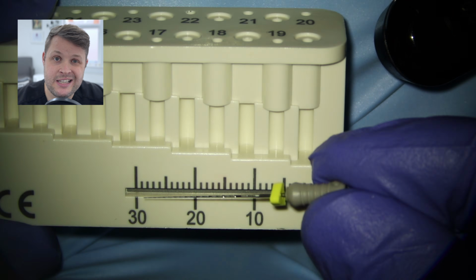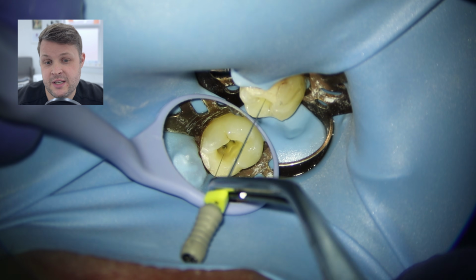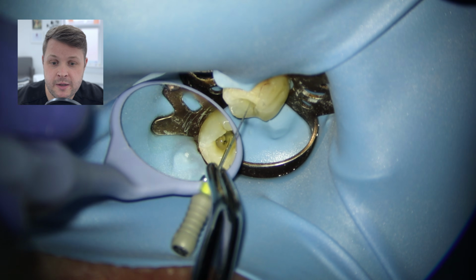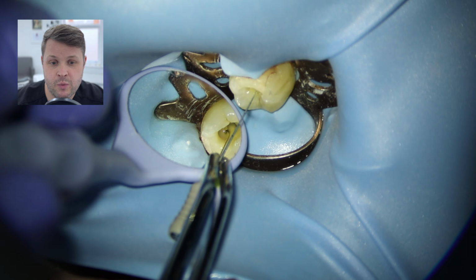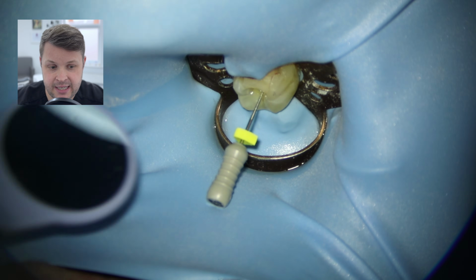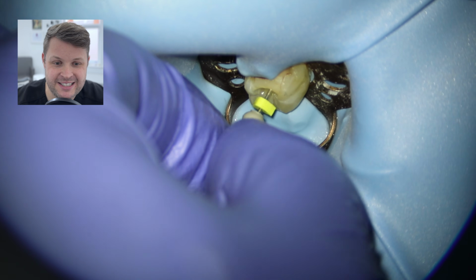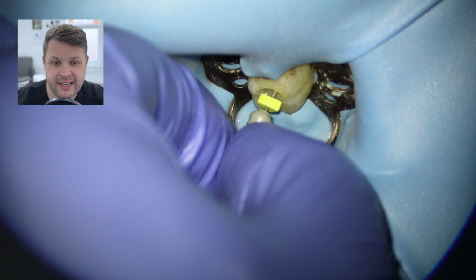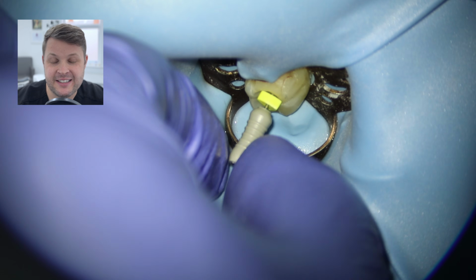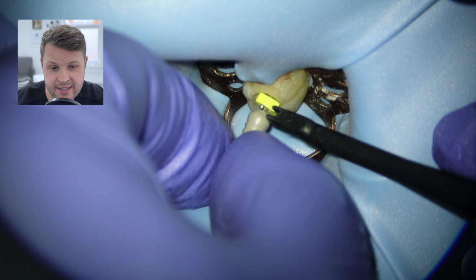So I'm going to use a size 8D finder in this case, and as I use this 8D finder, I've made a tiny little bend at the end, not too acute, and then I'm just using a gentle watch winding motion just to try and feel around for that patency in the canal. And as I gently push this D finder to length, we're going to get that lovely drop into the canal, and then we're going to put our apex locator on, and now we're getting 0.